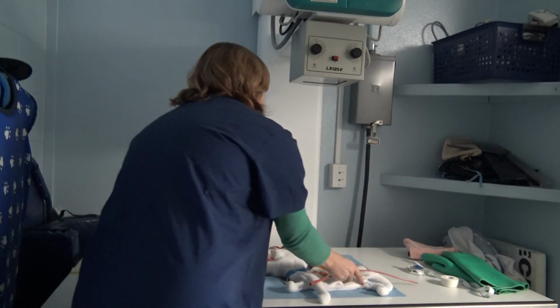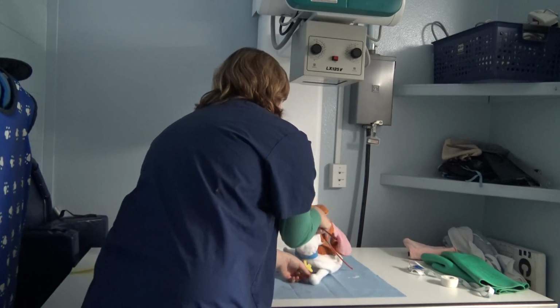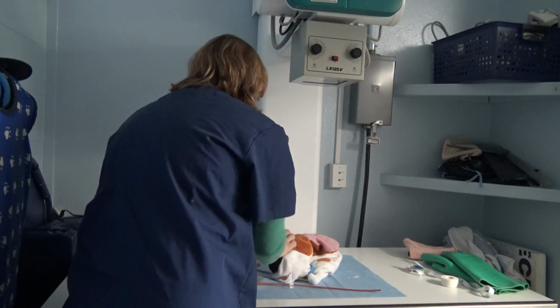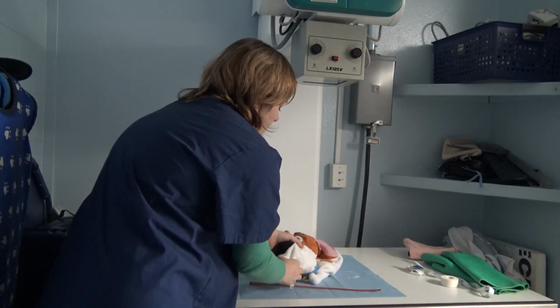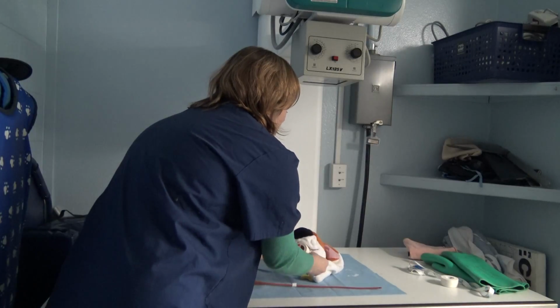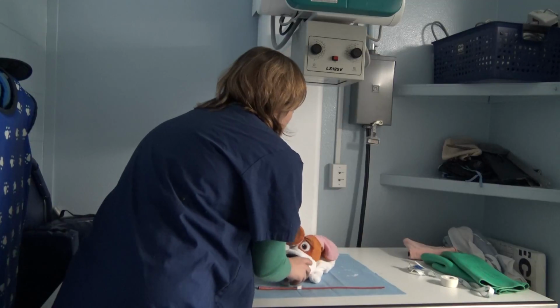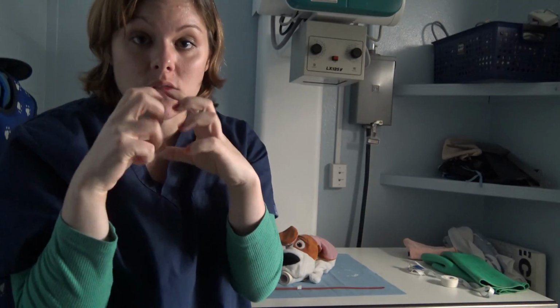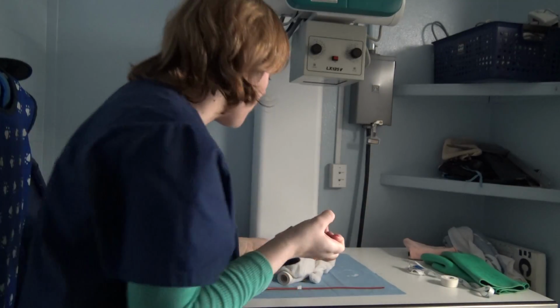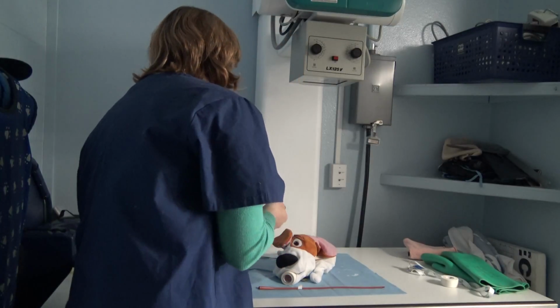I'm going to restrain our patient in sternal recumbency, and I'm going to go ahead and place his mouth gag in. You can use a roll of tape, or you can go ahead and use a mouth gag that you buy. If they're being difficult, sometimes we'll tape around the muzzle to make sure they're in, or you can restrain them, keeping them in.